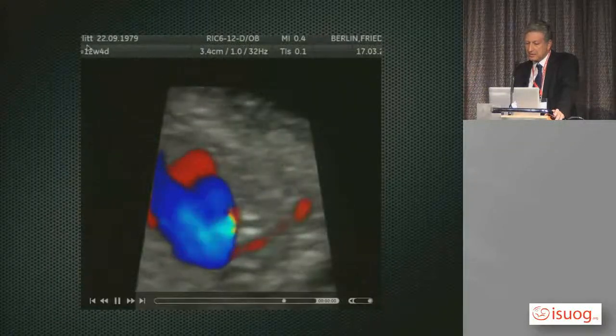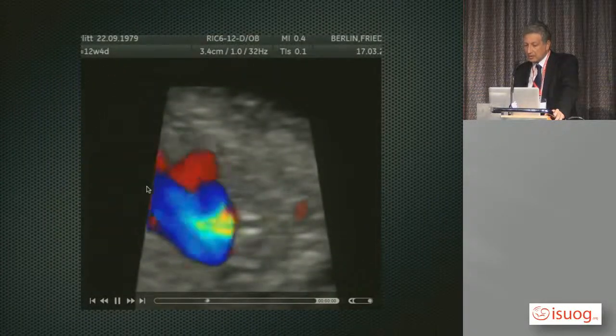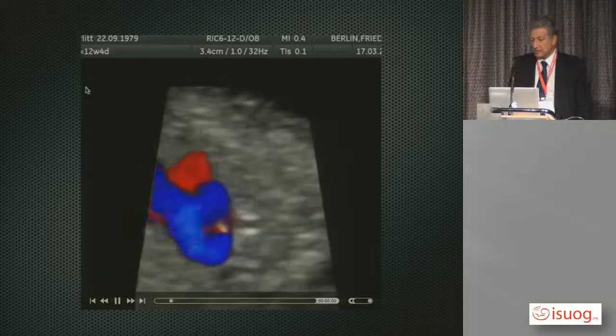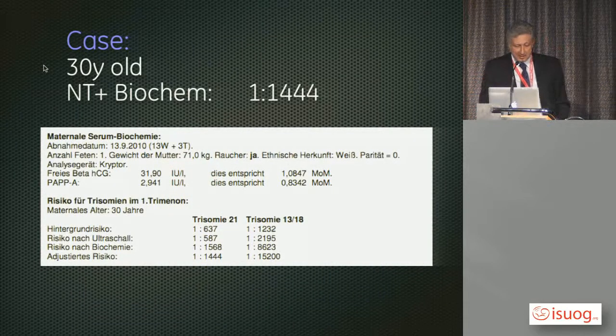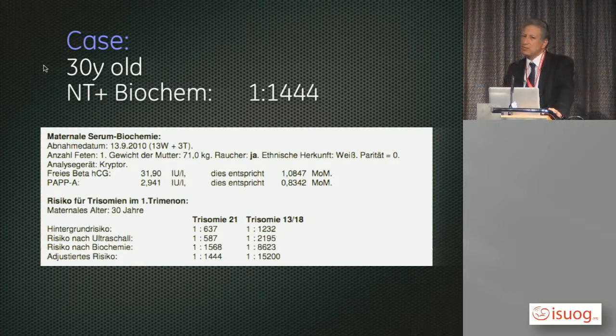And this is the same fetus. You see here, this is in March, the other one was in February. And this is the same fetus at 12 weeks with transvaginal scan and with the stick and the 3D rendering, you see the aberrant subclavian artery. Now, occasionally there are cases which make you wake up and say, wow, it's good that I did it. Sometimes I'm asked, are you obliged to do it in the first trimester? If you do the first trimester scan and you look at some additional signs, it's a pity to let a woman go home and discuss this at 22 weeks because you were lazy to look at the vessel early. If you are able to do it, go ahead and do it.